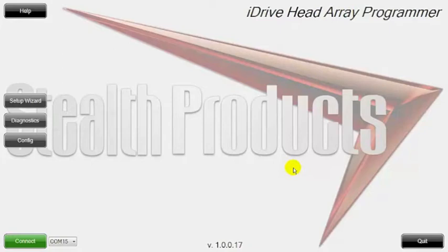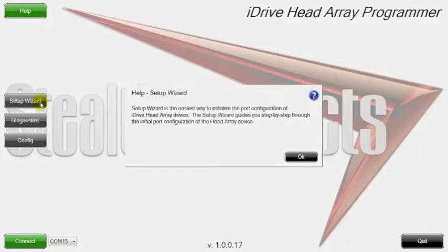The first useful tool here is our help button. When you click on the help button, you can see it lights up green. There's now a question mark on your cursor, and when you click on any button within the screen while the help button is on, it'll give you information about that section.